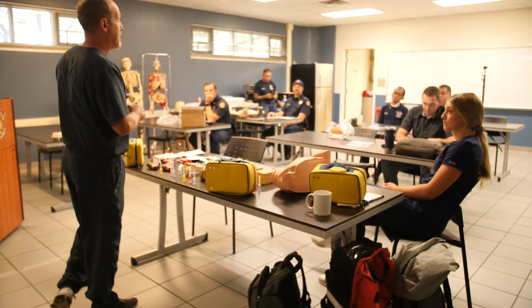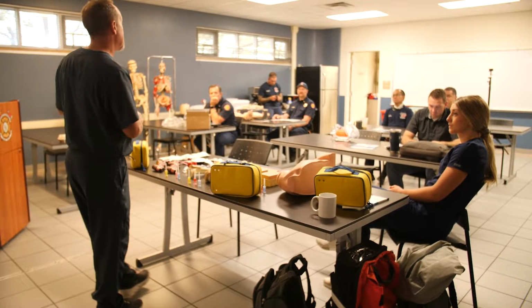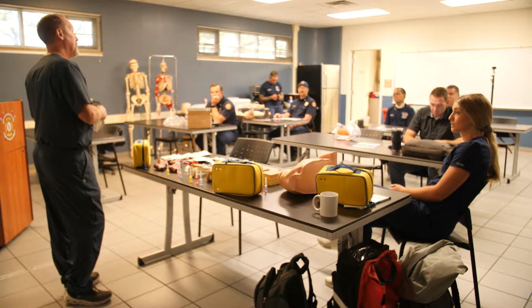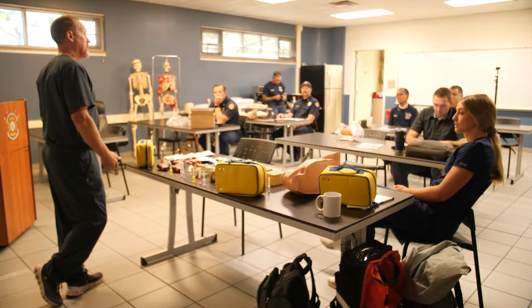Number one is that when we go into the proximal humerus, we can put 6.3 liters of fluid per hour into that patient, okay? When we go into the legs, it's more like a liter per hour.